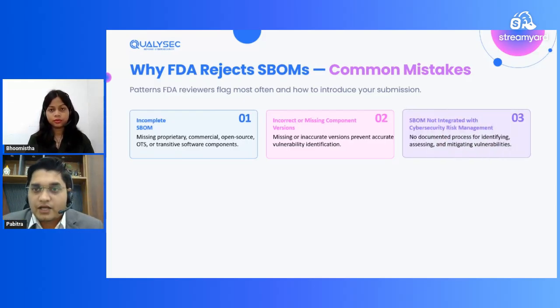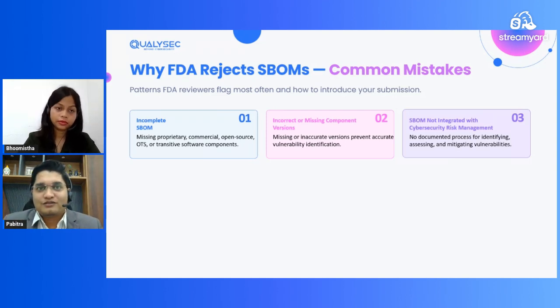And a very important thing here: the SBOM is not integrated with cybersecurity management. What does that mean? Most people know that the FDA needs an SBOM report. So they generate the SBOM report, but that's not exactly what the FDA is looking for.